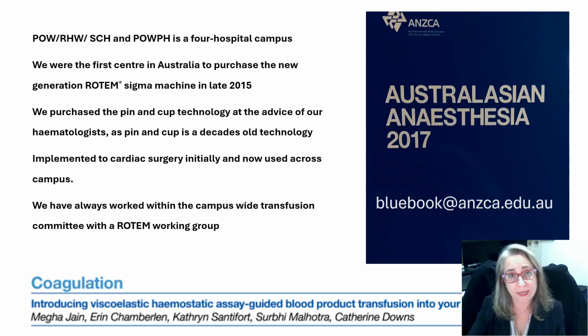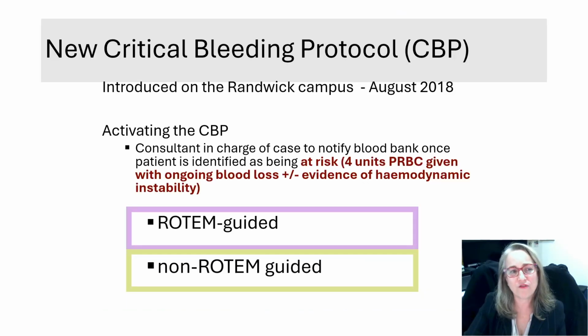We've always worked within the campus-wide transfusion committee, and we wrote this up in Australasian Anaesthesia 2017. So you can get a copy of this if you Google it, or if you email the Blue Book people at the College of Anaesthetists. Our article, called Viscoelastic Haemostatic Assay Guided Blood Product Transfusion and How to Introduce It into Your Hospital, is as relevant today as it is to any centre that has not yet implemented this technology. It goes through all the pitfalls and how we got people engaged, and we really made it interdisciplinary.